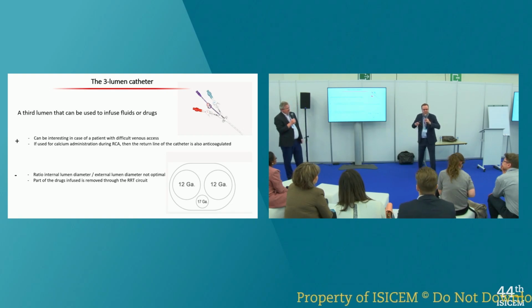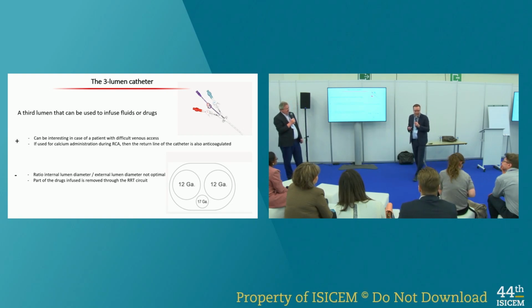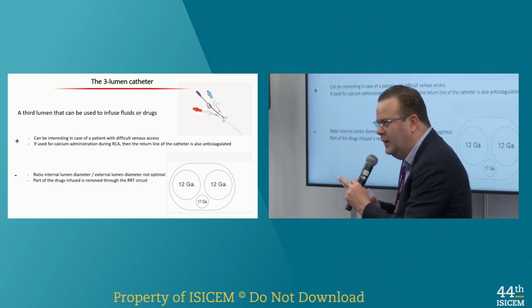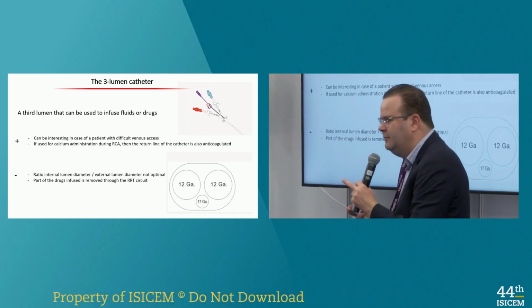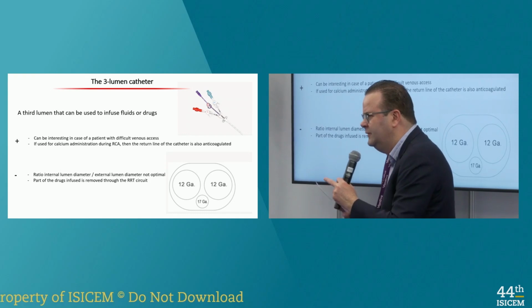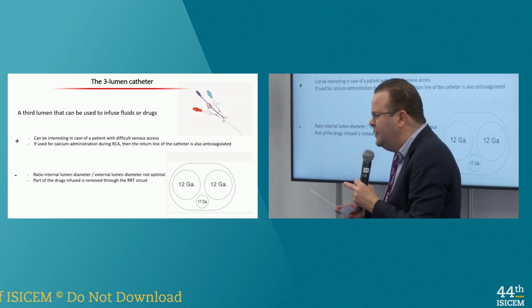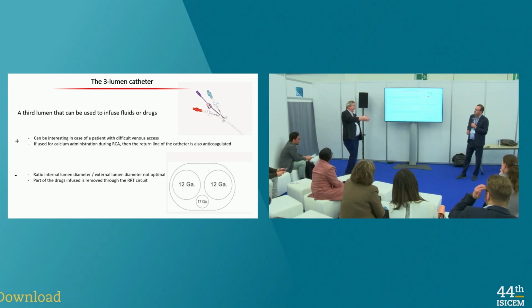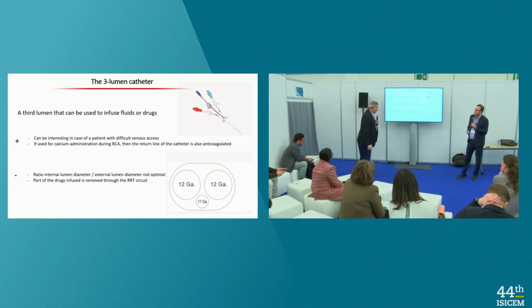But as Patrick said, now the catheter is much softer than before. Polyurethane, silicone, it's okay. And then I think this risk is now minimal, right? Exactly. And in the recent study published last year, another one, exactly the same rate. No more, no less.